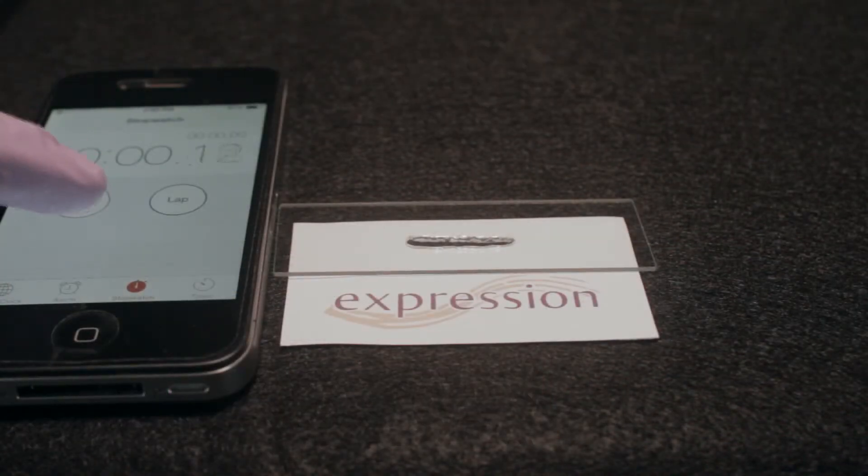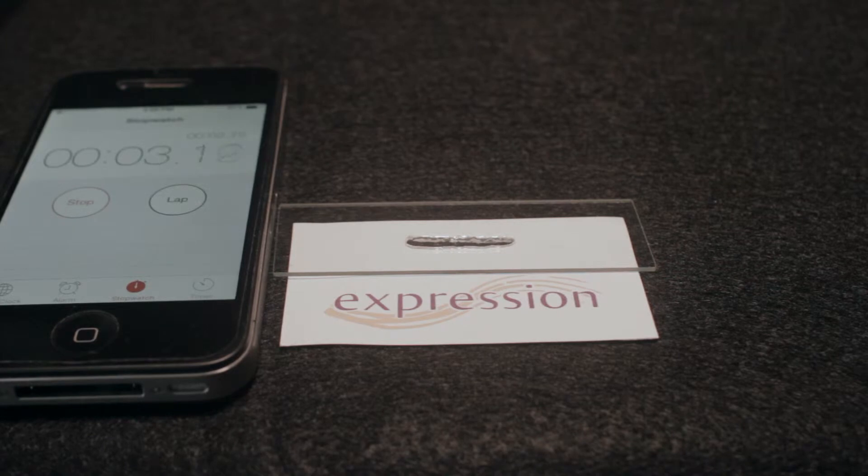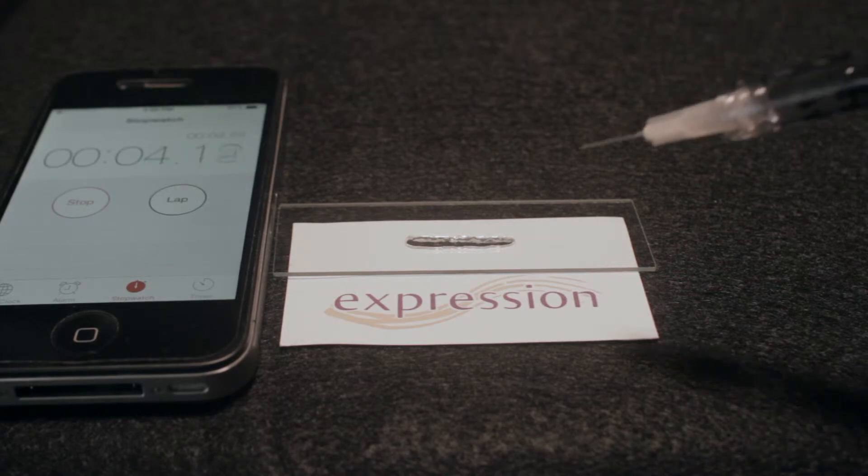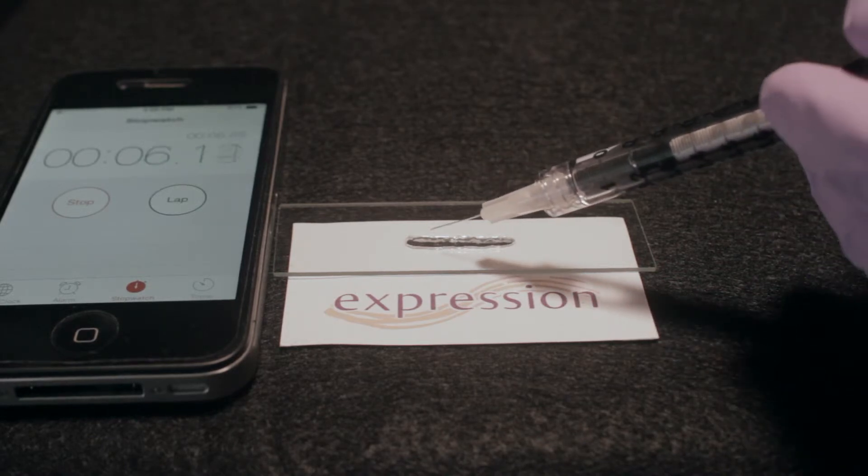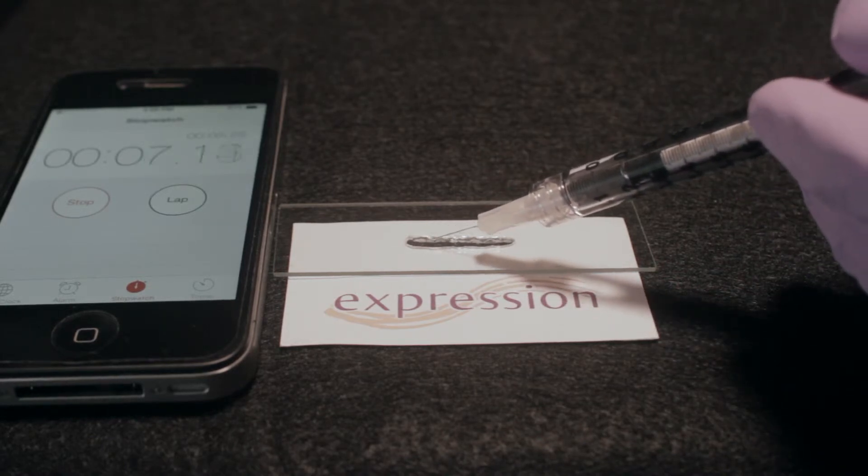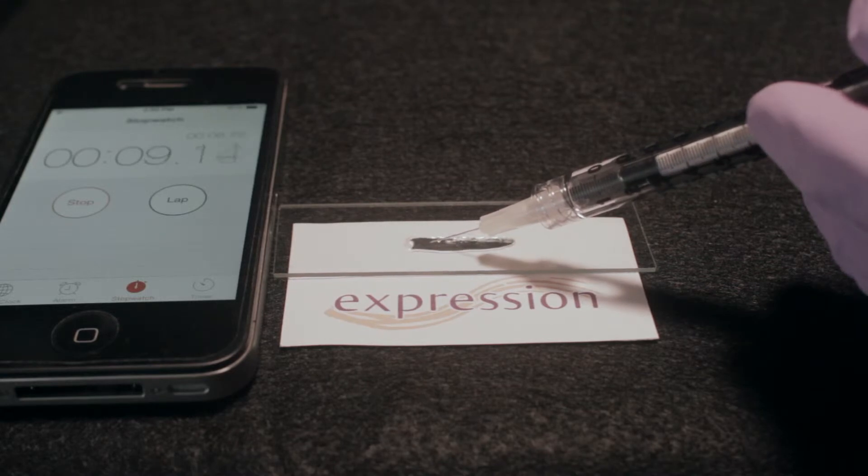After placing a timer beside the slide, I will start the clock and inject the hyaluronidase into the expression hyaluronic acid, selecting 3 to 4 locations in the tube of HA.